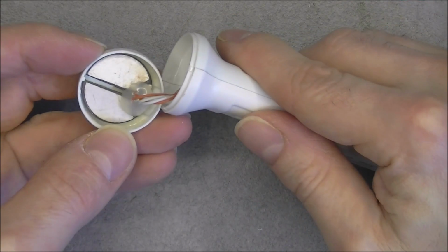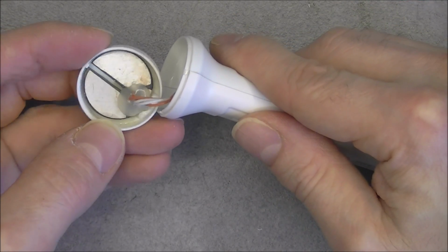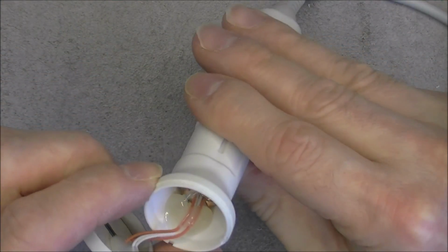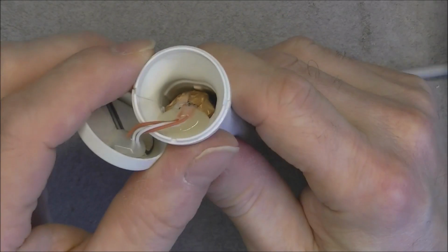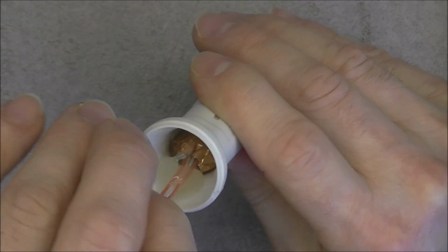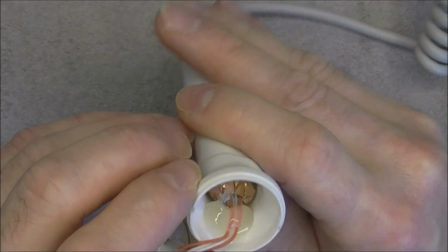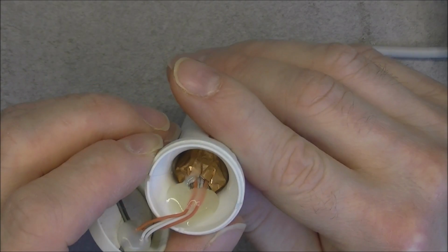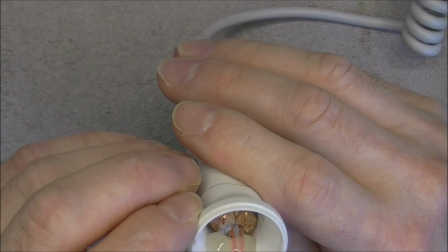But as you can see, they are completely glued to the front, so I will not try further to remove them. But in here we have, interestingly enough, what seems to be a PCB and some copper foil shielding. So let's try to open this part.